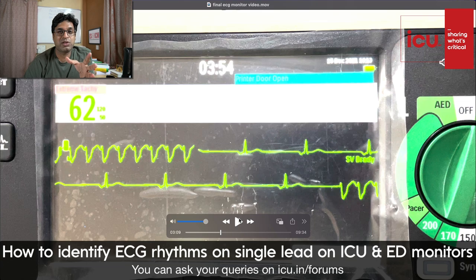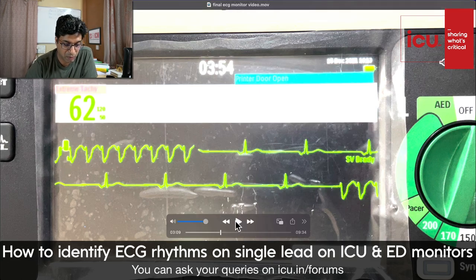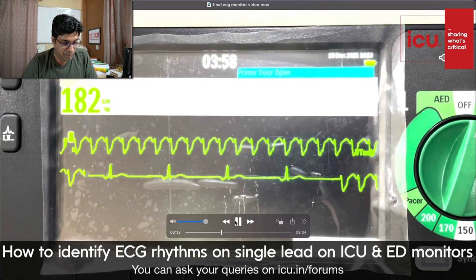Anybody who is in the ICU should be able to identify the one rhythm which is VT, ventricular tachycardia. Why? Broad QRS complexes originating in the ventricles, that's why they are broad. And the rate is more than 100, that's why we call it tachycardia. Because all complexes' morphology is the same, it's a monomorphic VT. So this is a ventricular tachycardia, VT.